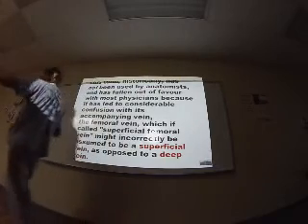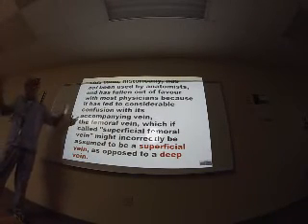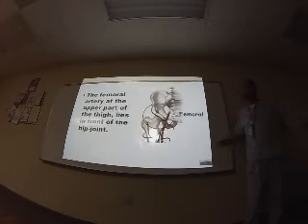That depends on where you're working. If your radiologist uses superficial, use superficial. If your radiologist doesn't use superficial, don't use it. Remember, you are going to scan exactly as the radiologist wants.